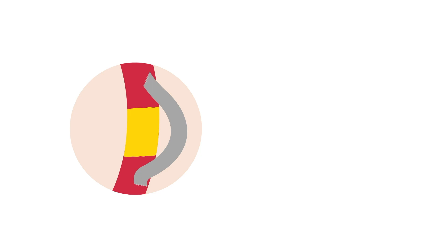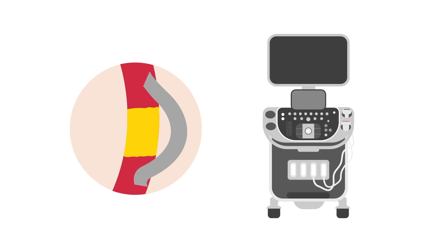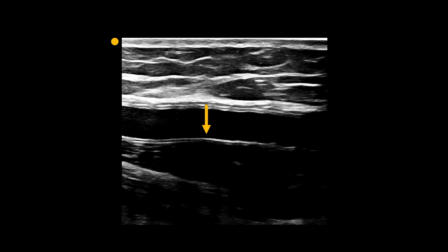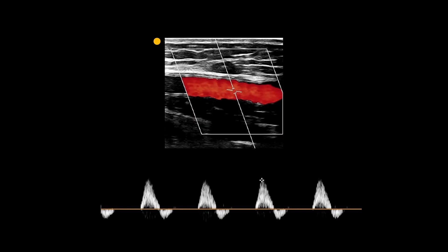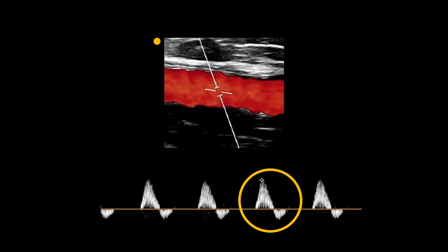The synthetic bypass grafts are usually pretty easy to recognize on ultrasound. Notice the synthetic graft on this ultrasound. They are interrogated the same way as stents. The only difference is that we use slightly different terminology — we use the terms proximal and distal anastomosis for the grafts instead of attachments. The bypass graft looks like a vessel with the same color fill and waveforms as a normal healthy artery. However, it has a patterned edge and often has a more superficial path compared to the SFA.